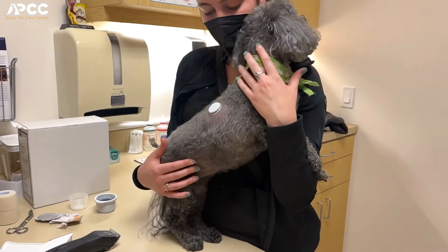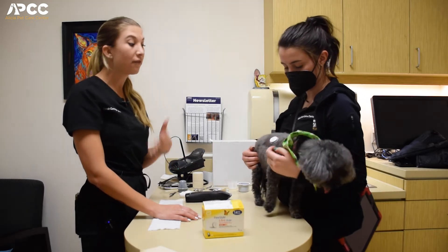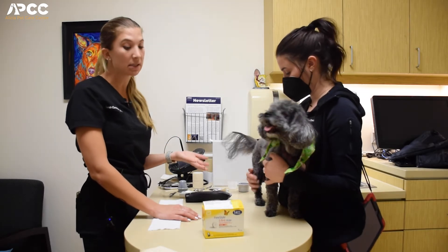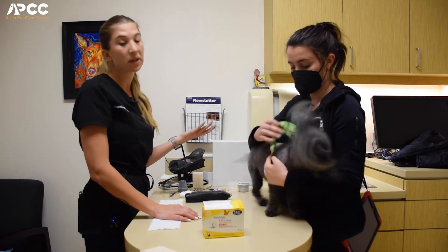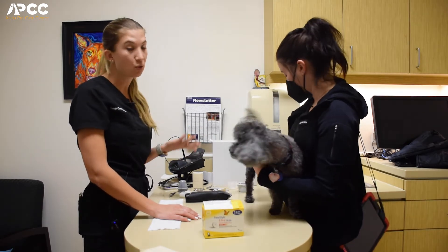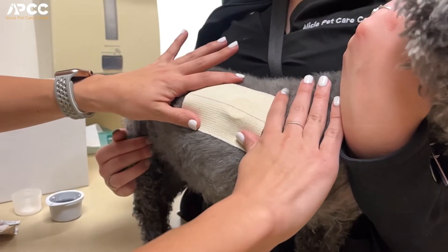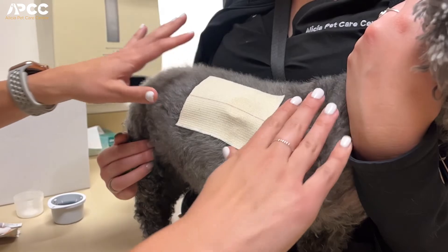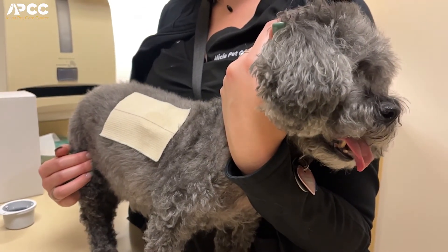This is what's going to stay on the patient for 14 days. The benefit of doing the Freestyle Libre is that we get 14 days of continuous blood glucose readings, whereas if we did it in hospital we would really only be getting about 12 hours maximum. On top of the sensor we do place a small piece of tape just to make sure that they're not able to peel it up at all.